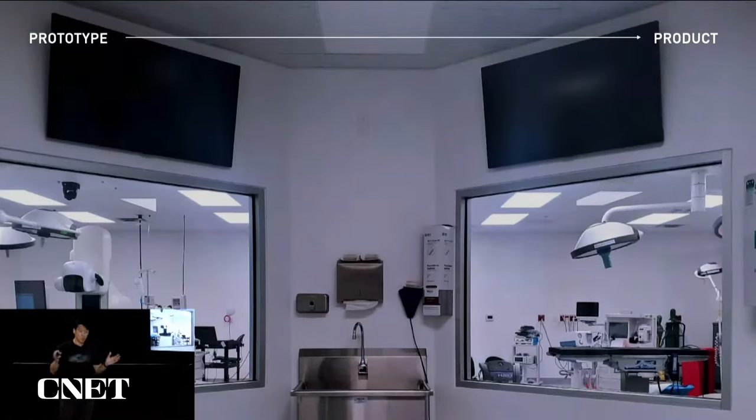We've also scaled up our surgery — we now have our own dedicated OR, in fact a double OR in Austin, and this is just a stepping stone before we eventually build our own Neuralink clinic.